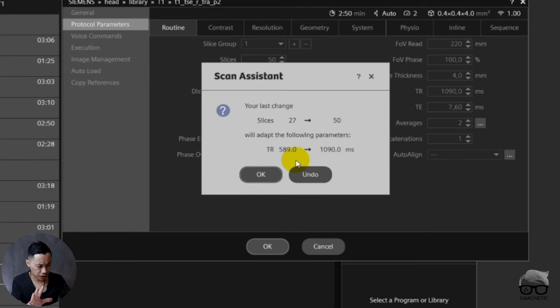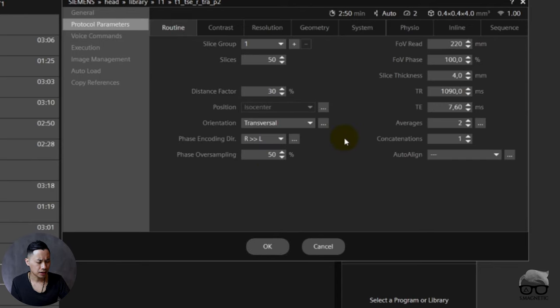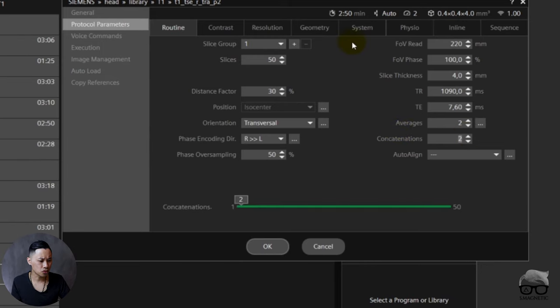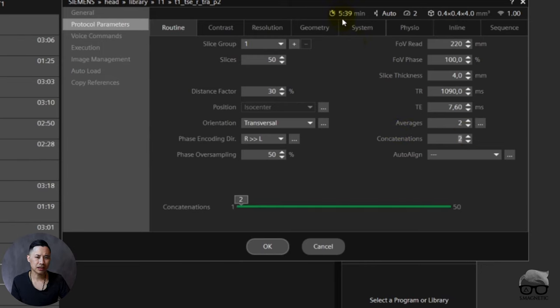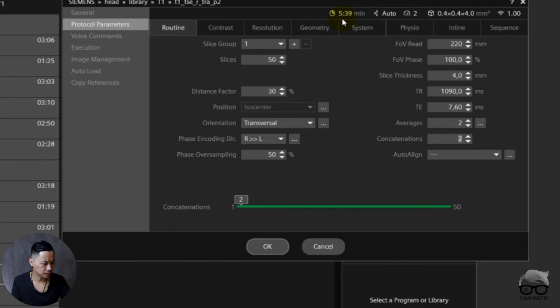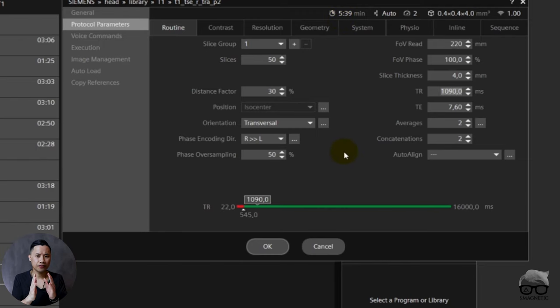So just accept this one and we're going to do some magic here. What we do now is we have 50 slices as we wanted, and we now added two concats. You just see the time increases, doubles up, because now you're running the TR twice, so of course it will double. But now look, we have 50 slices.